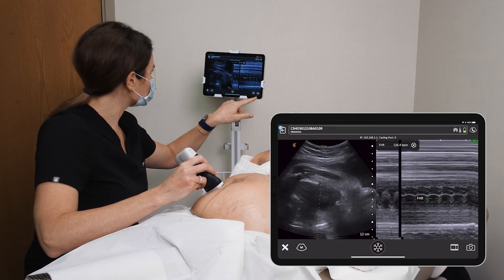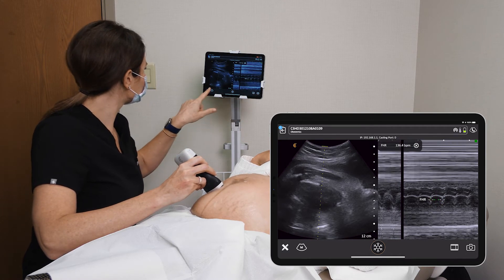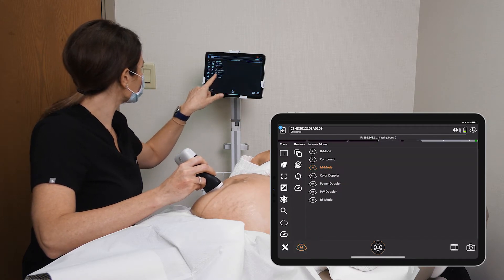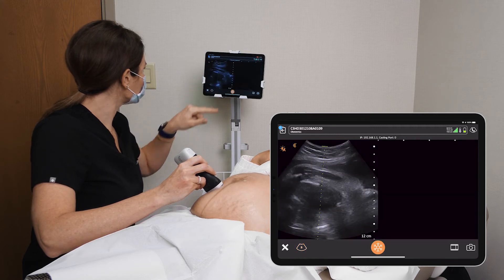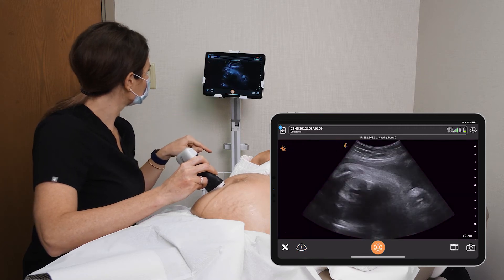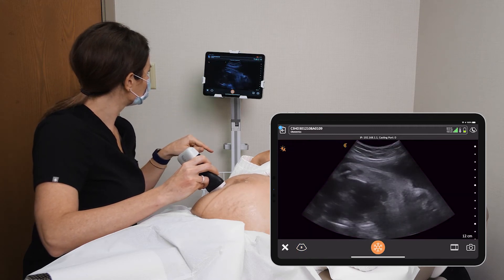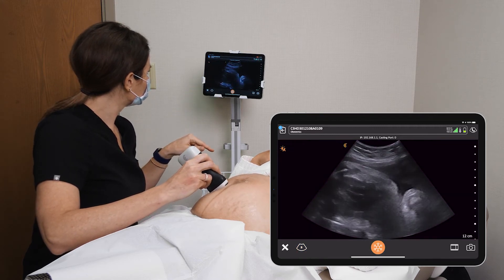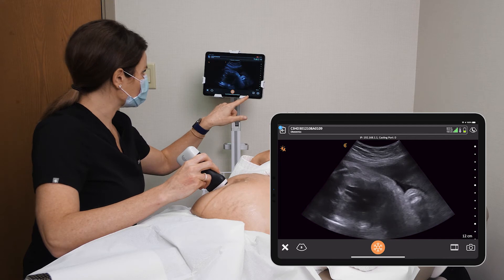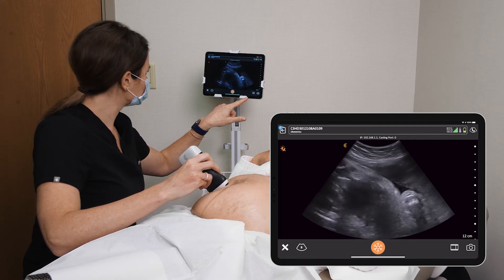Take a picture of that and go back to our B-mode here. You can actually take a little video of the heart beating there.